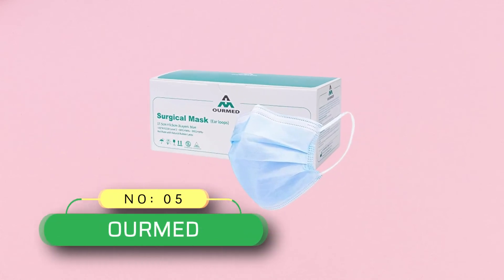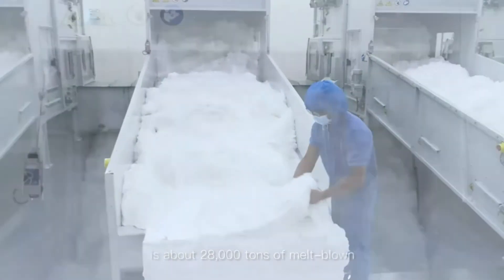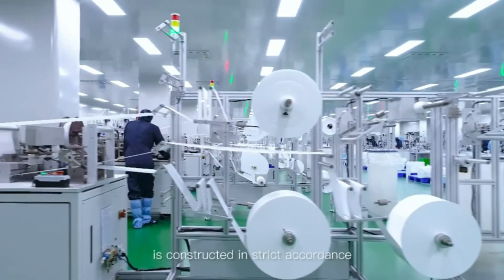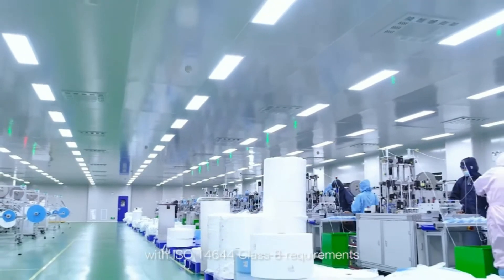Number 5: OURMED ASTM Level 3 Surgical Mask Made in USA. The OURMED Surgical Mask is designed and manufactured by OURMED Medical Products Company. Its lightweight non-woven fabric design achieves strong protection while enabling breathable and comfortable wear for home, office, or public places. This surgical mask consists of three layers of high-quality non-woven materials.